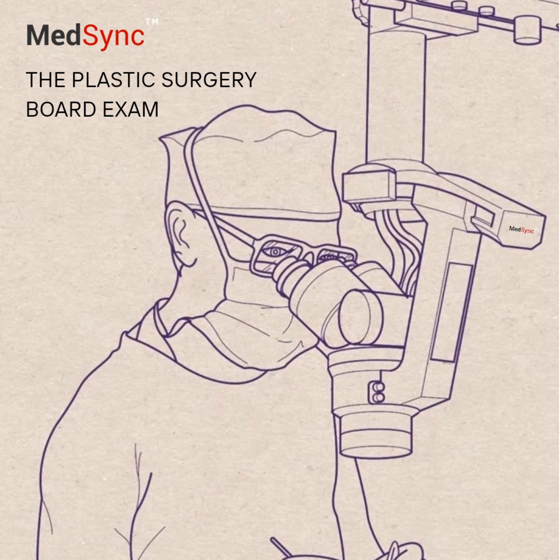What lasers are typically used? A range: KTP at 532 nm, pulsed dye lasers, PDL, around 585 or 600 nm, Alexandrite 755, diode lasers at various wavelengths like 800, 810, 940, 980. Nd:YAG 1064 nm. Yes, and IPL can also be used, covering a broad spectrum from 400 to 1300 nm.